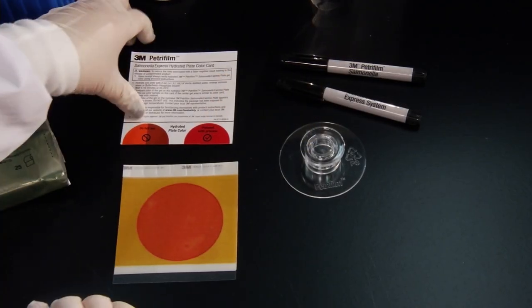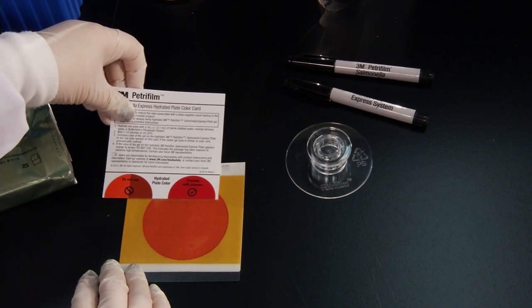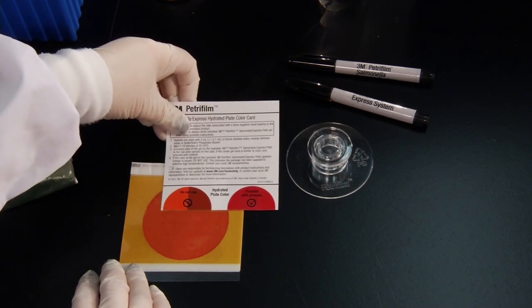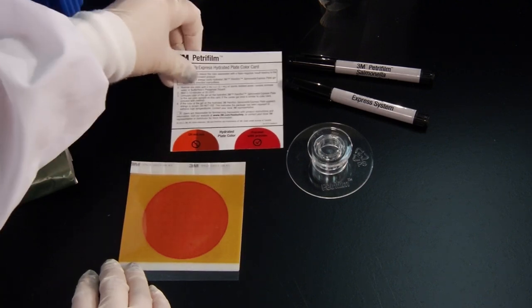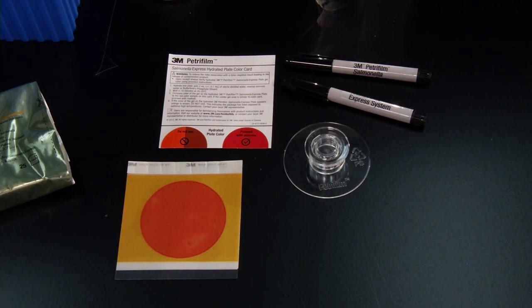After a few minutes, check the hydrated plate gel color using the 3M PetriFilm Salmonella Express Hydrated Plate Color Card. If the gel color is red, the plates are good to use. If the gel color is orange to brown, the plates have been exposed to extreme high temperatures and product performance may be impacted. Do not use the plates and contact your local 3M food safety representative.